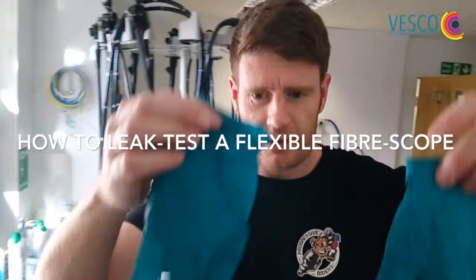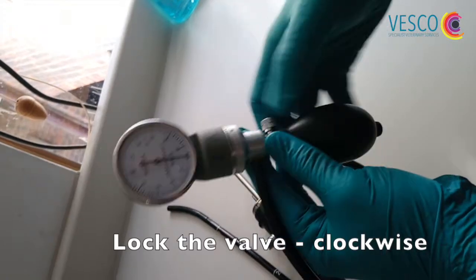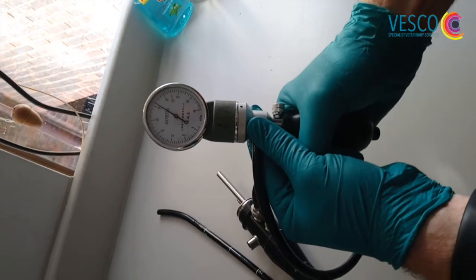Welcome to Tech Time. I'm going to show you how to leak test a scope. First I'm going to put on my gloves and take my leak tester and connect it to the ETO valve. I lock the valve and put some air into the scope.